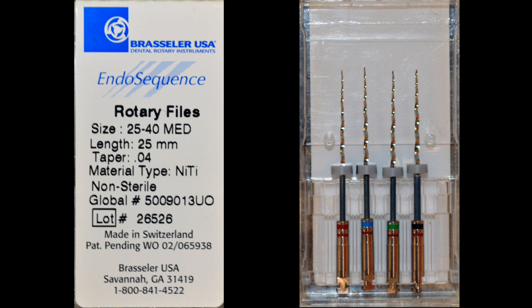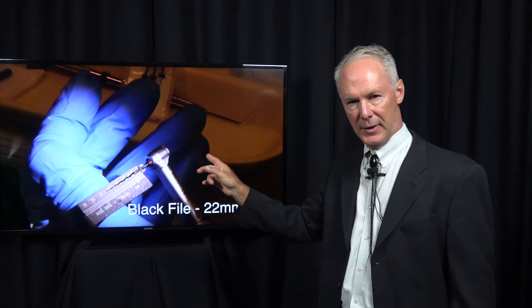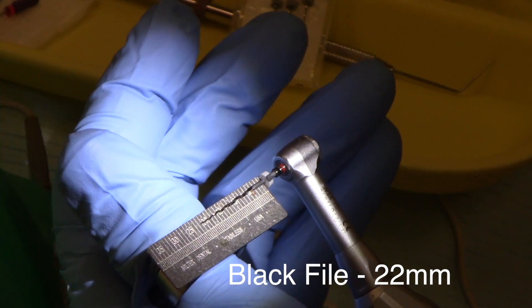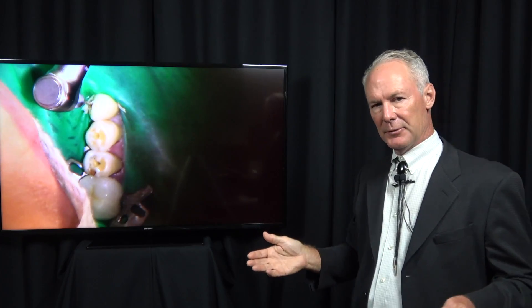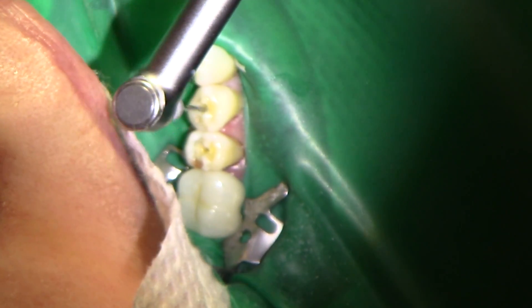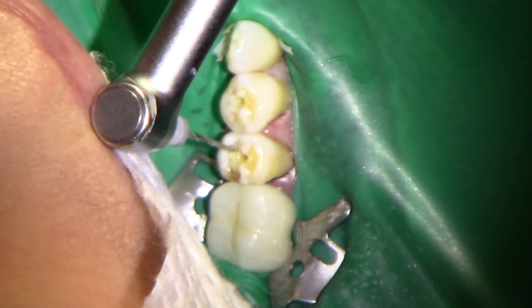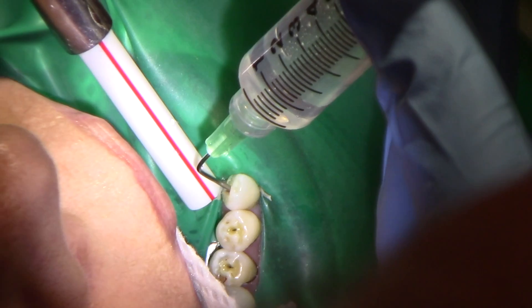The black file is the 40. It's the largest file in this sequence. I know I'm not going to go to length with this file — I'm just trying to open up the coronal part of the canal so that it will hold the sodium hypochlorite and water. This is called the crown down technique. You want to very lightly go down and then up — three times is ideal, no more than about five. Fill the canal up with sodium hypochlorite. You want lubrication; don't let the canal be dry. Drip sodium hypochlorite into the orifice so there's lots of lubrication. Irrigate each time.